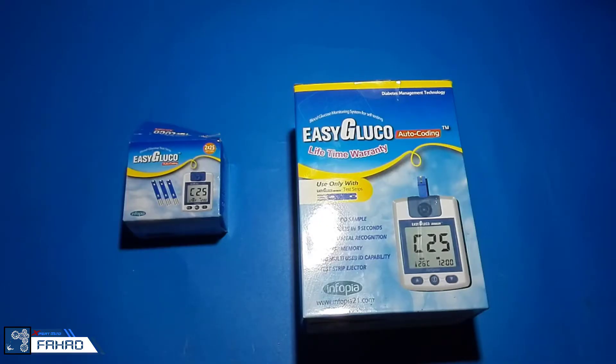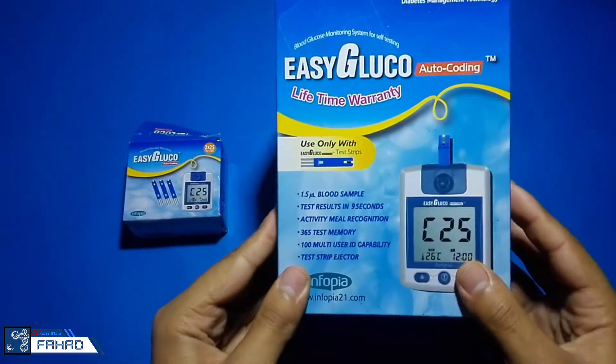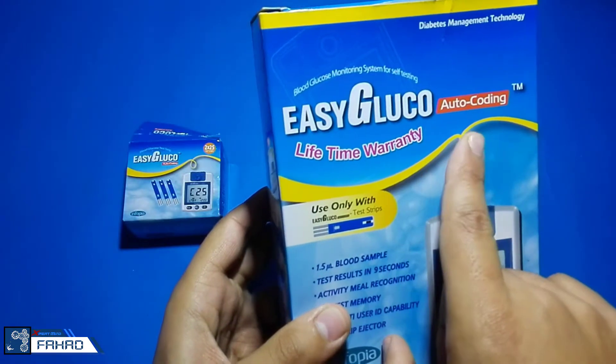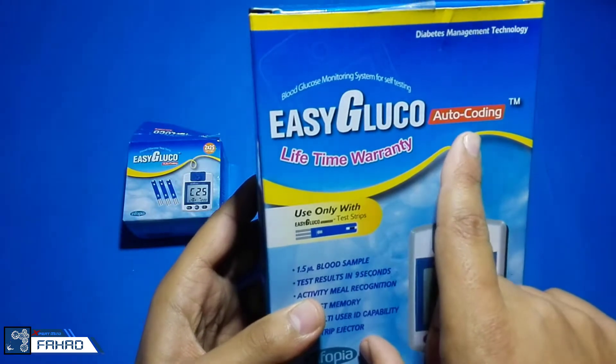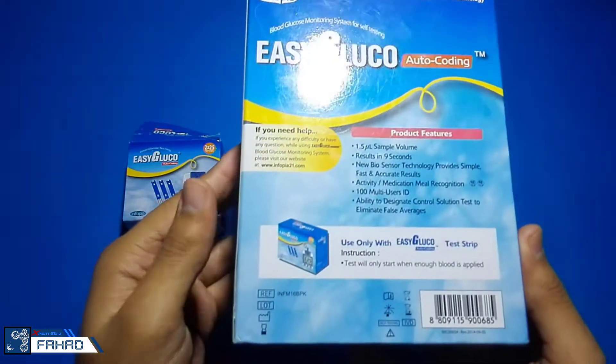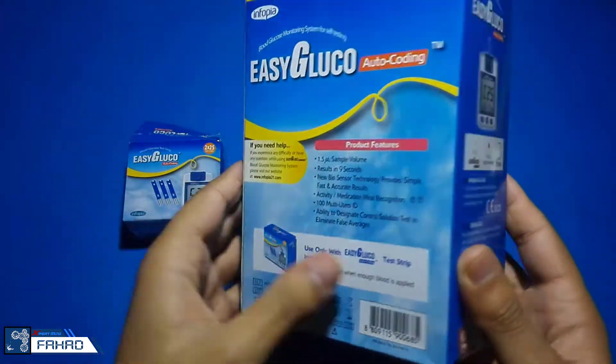I bought this glucose meter for nearly 25 bucks. It is Easy Glucose, as you can see, and it is made in Korea. It contains a glucose meter, some strips, and a lancing device.